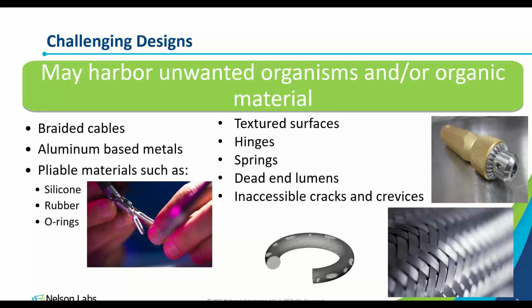So it will present some challenge. I can't necessarily guarantee that it'll pass or that it'll fail. I don't want to dash your hopes. It will present a great challenge. So there is going to be a lot of areas where organisms or organic material, as was showing on the screen, is going to be able to hide and will be difficult to remove. So an easy way to get around some of these challenging designs is to allow your device to be disassembled.